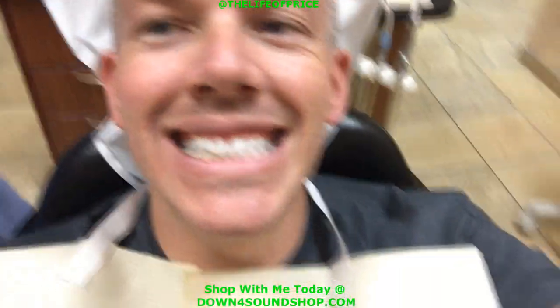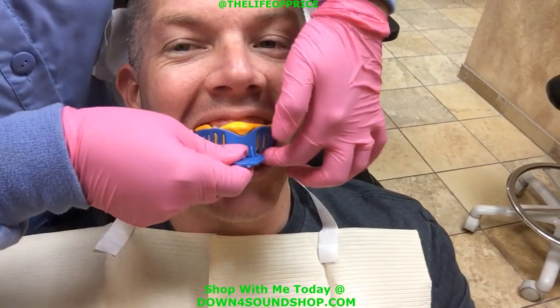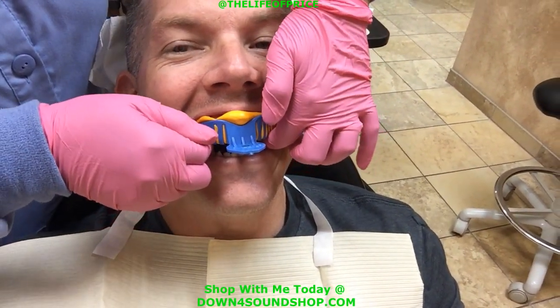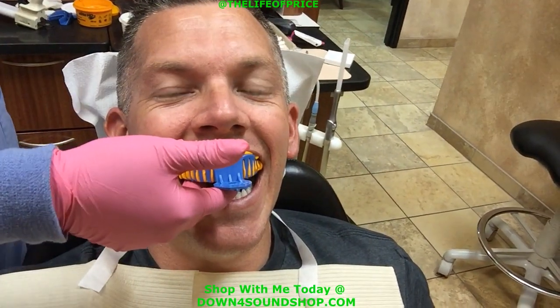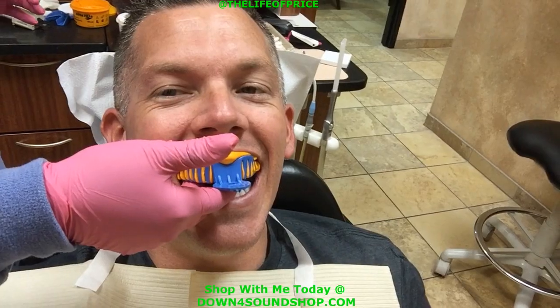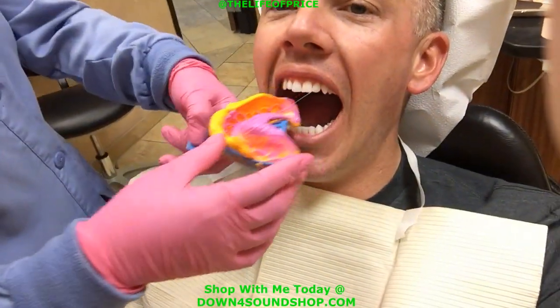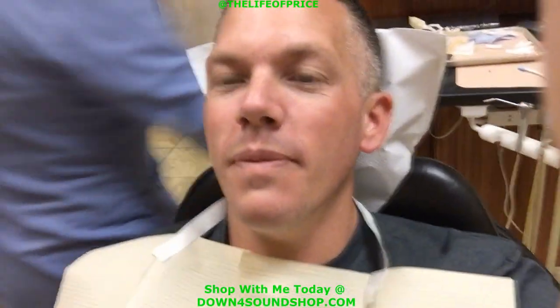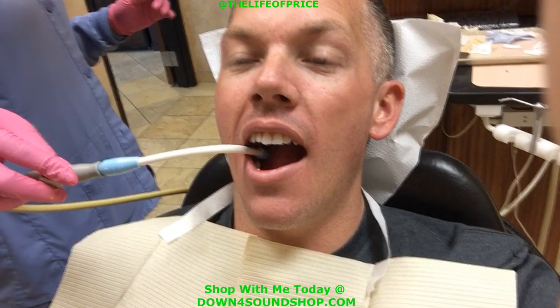Here we go. So this is going to be the before. Alright, open real big. About 4 minutes on that, okay? There's some suction in it. I'm tough.